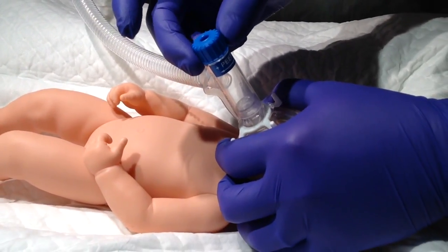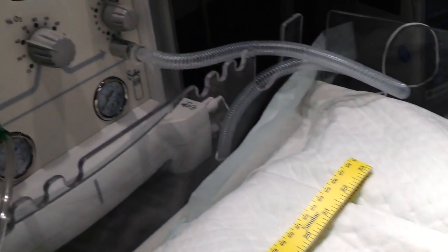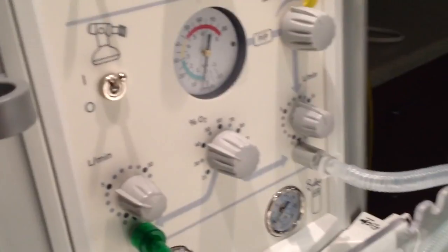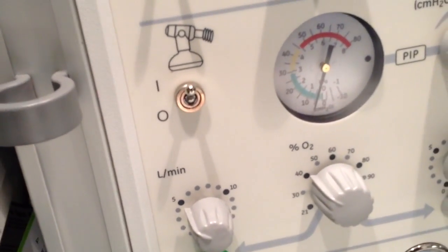You can always use this as free flow CPAP on a baby as well without giving breaths. Just turn the dial at the top of the mask and you'll see the pressure go up to around 4 or 5, and just hold it over the baby's face to adjust your CPAP pressure.